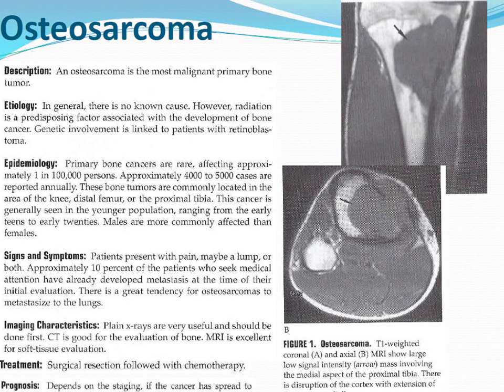But frequently, metastatic disease from osteosarcoma sets up in the lungs. So you'll see that the patients, once they have an MRI with you, will often be going on to CT or to get a chest X-ray. These ones you may be able to see on plain film, because they're quite aggressive. They create some pretty dramatic changes in the bone, some really characteristic findings on X-ray.